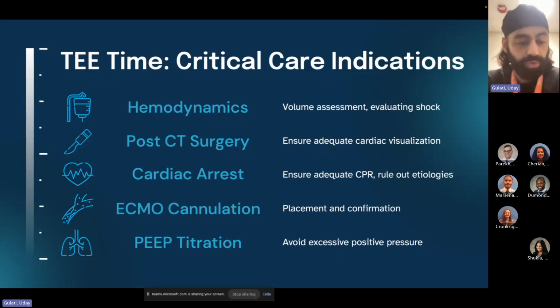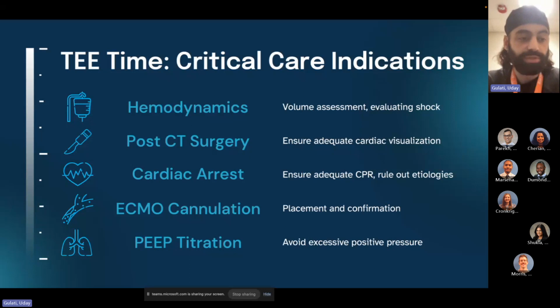And then there's some case reports, or even some expert opinion, where they'll put in the esophageal probe, they'll look at the RV and it's massively distended. They'll come down on their PEEP, figure out another way to make sure they adequately recruit the patient. And the moment they come down on that PEEP, that RV undistends because it's all acute, and their hemodynamics improve, right? So many, many different ways to use this, but for many of the ways that we use transthoracic echo, you can use it for transesophageal echo, right?